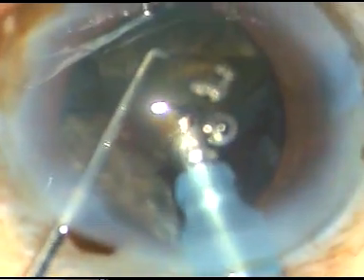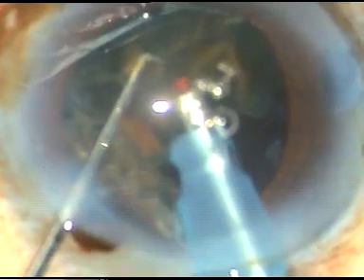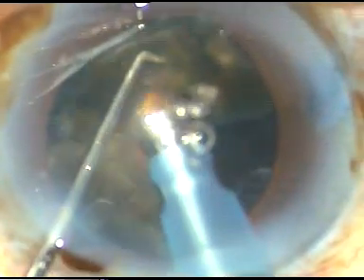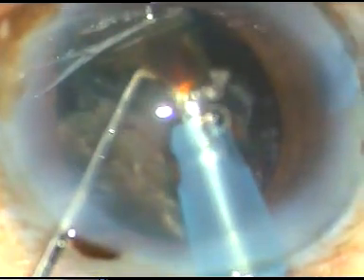At this time I can see some prolapse of iris. The pupil is nicely dilated and it has been dilated well through the surgery. Now at this time the pupil is tending to become a little small, but still it is quite well dilated and the surgery can be managed nicely.